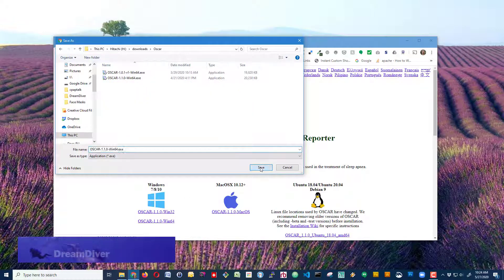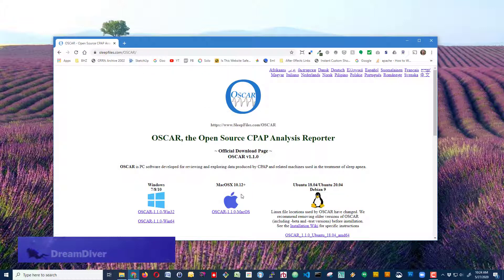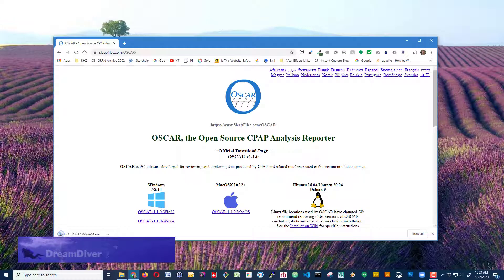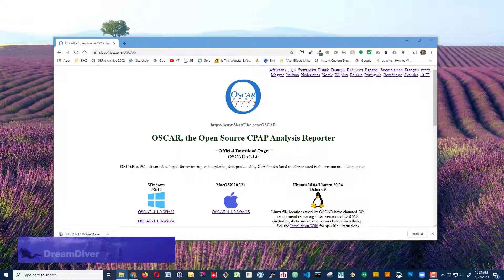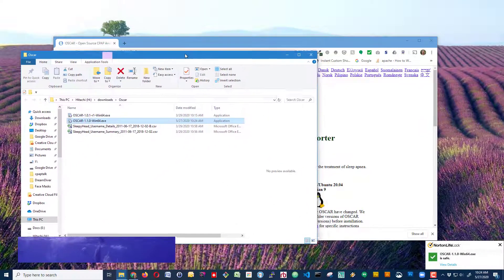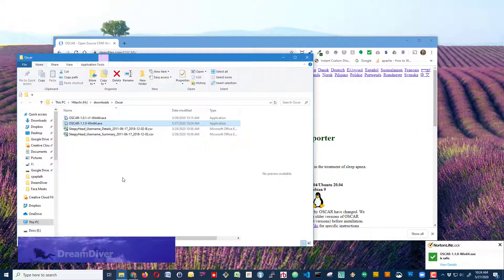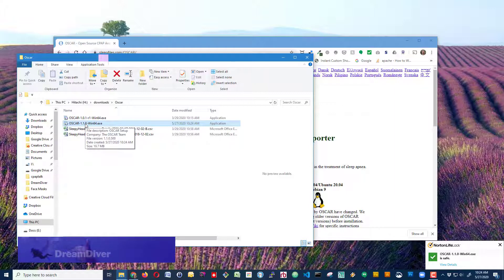I already downloaded it once, but we'll just go ahead and replace it, and we'll just show it in the folder. Now that I have it, all I need to do is double-click on my installer.